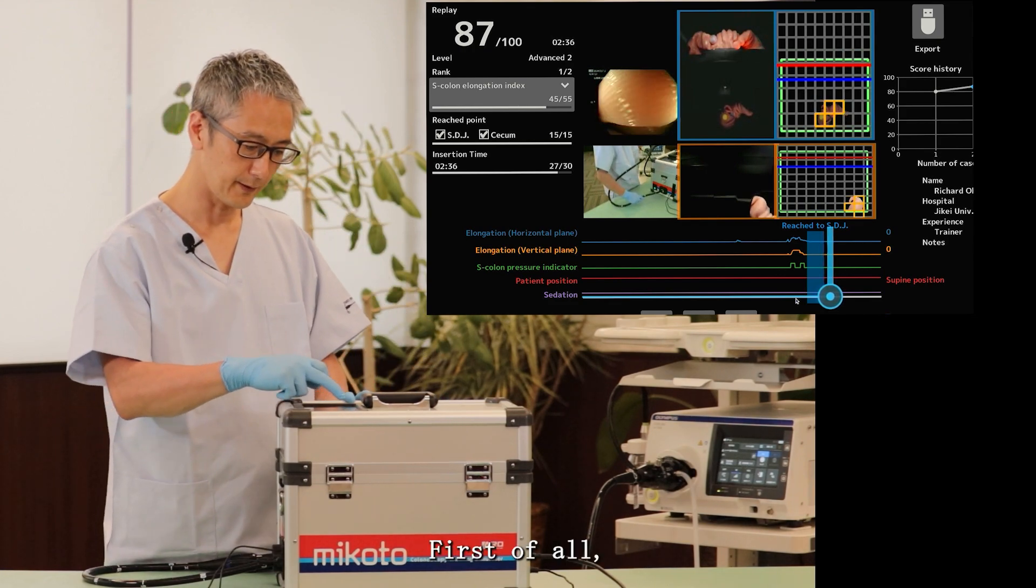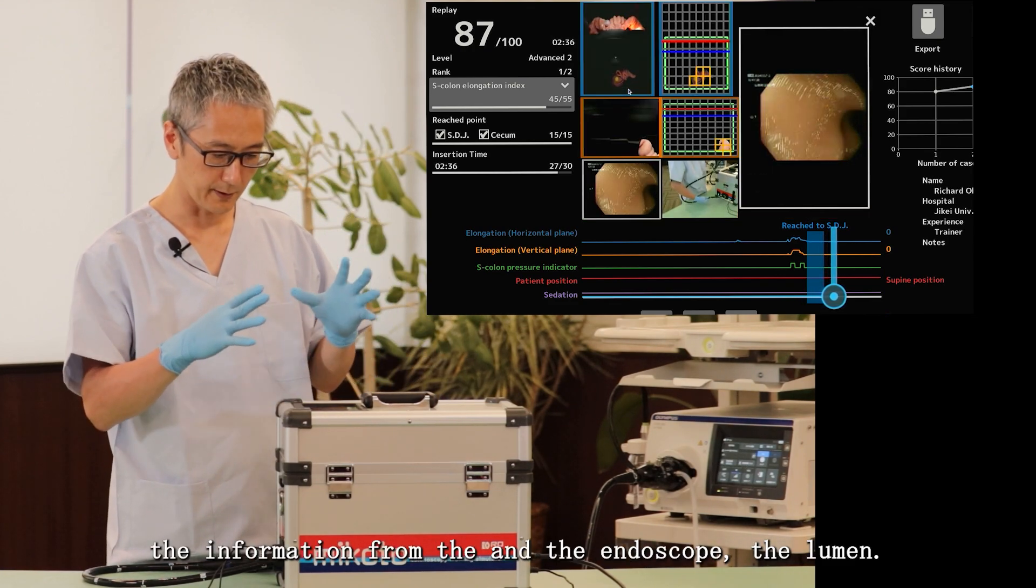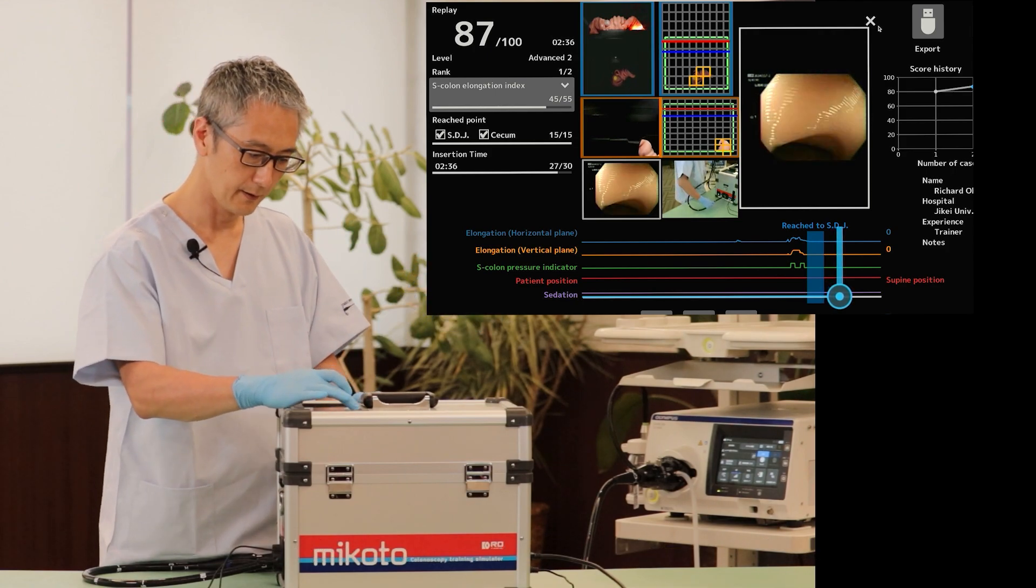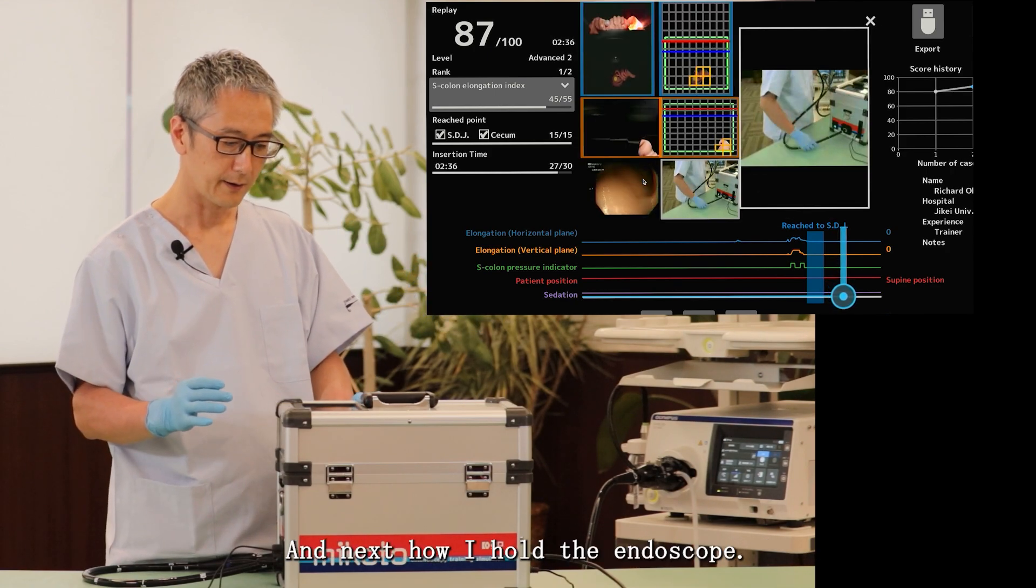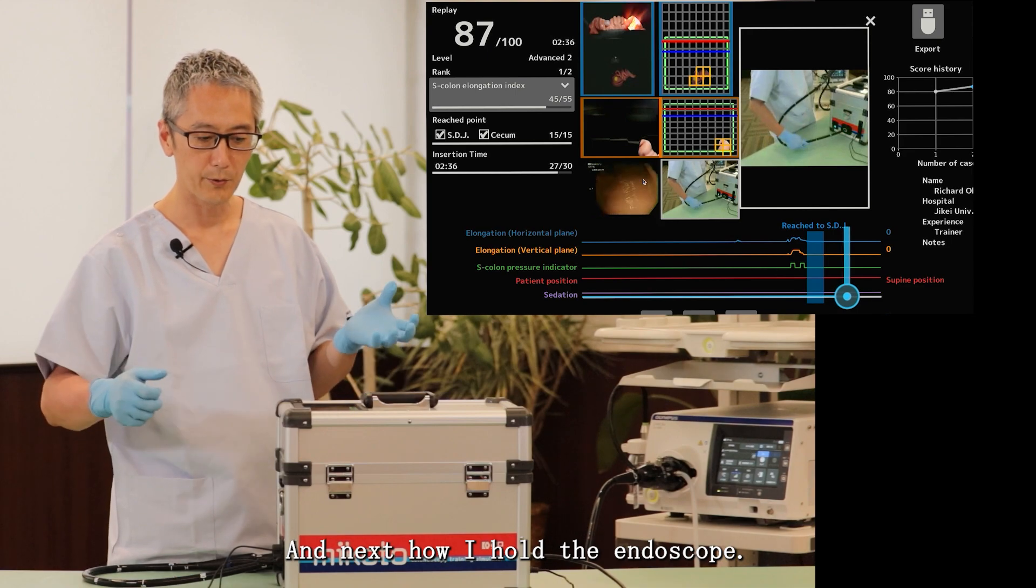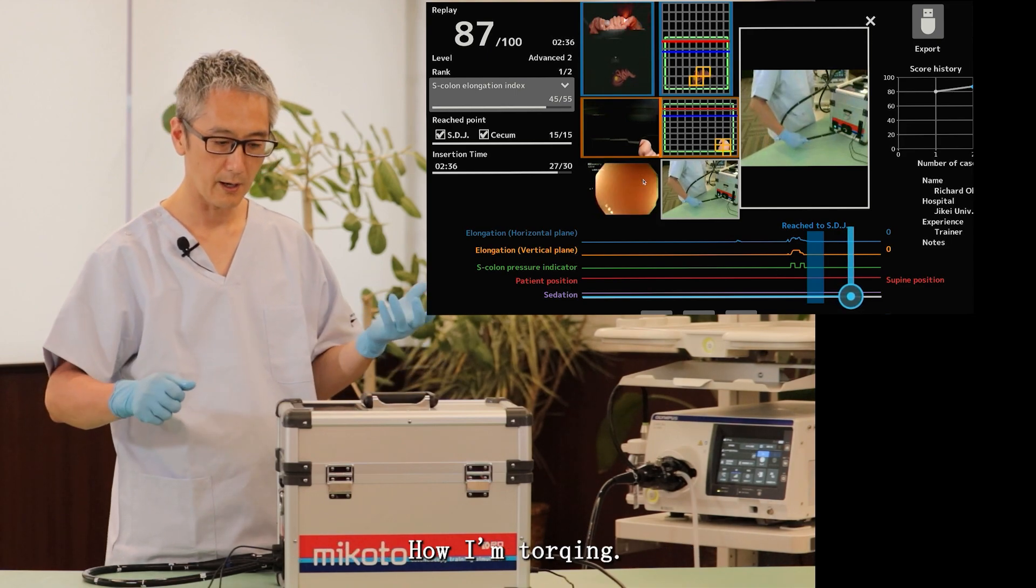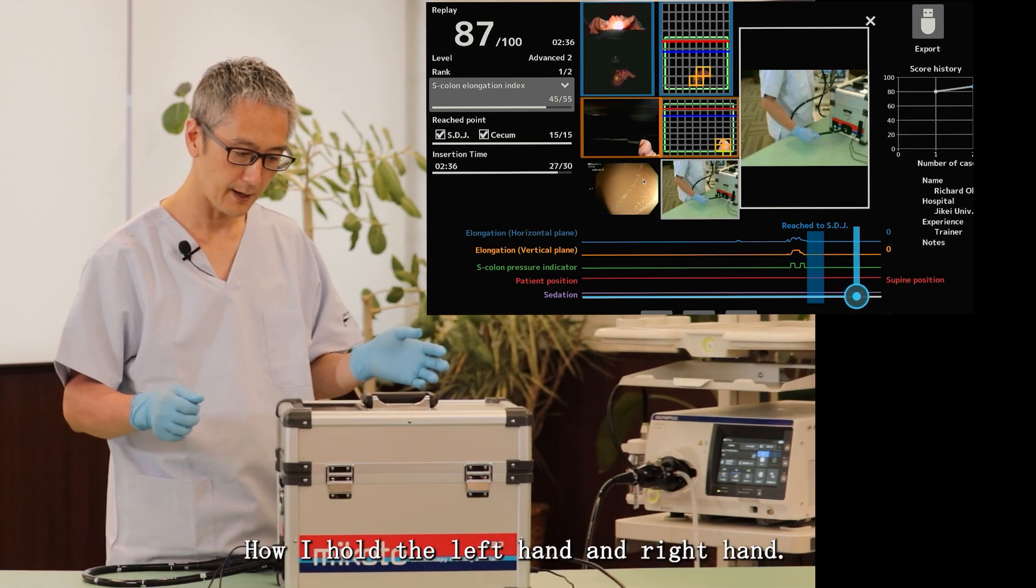First of all, the information from the endoscope, the lumen. Next, how I hold the endoscope, how I'm torquing, how I hold the left hand and right hand.